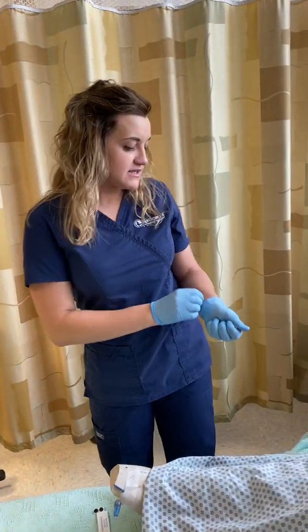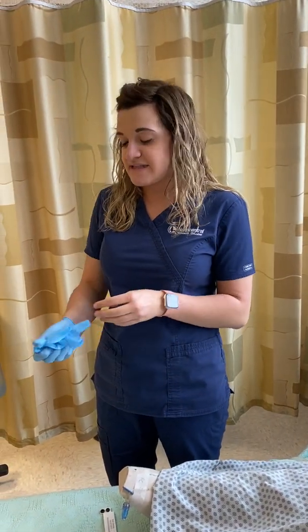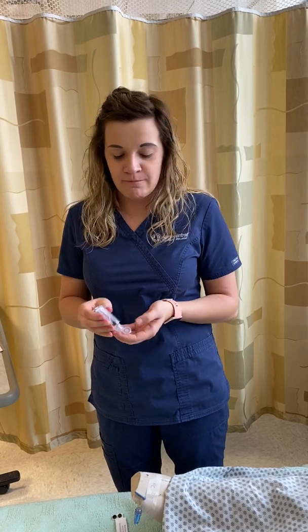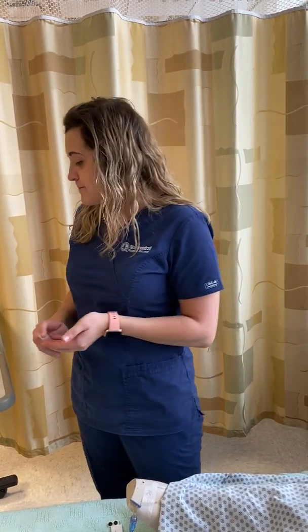And document. So what I would want to document is time, date, how the patient handled the medication, the amount given, which route you used, and then you would want to come back in about 10 to 15 minutes, check some vitals, reassess the pain to see if that med was effective or not, and chart that assessment then.